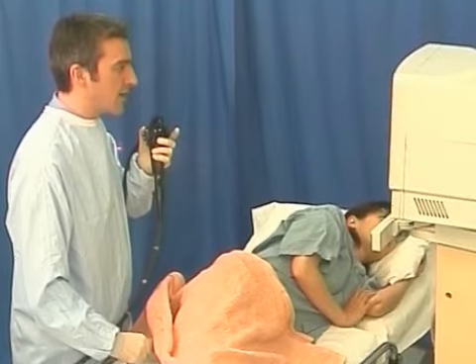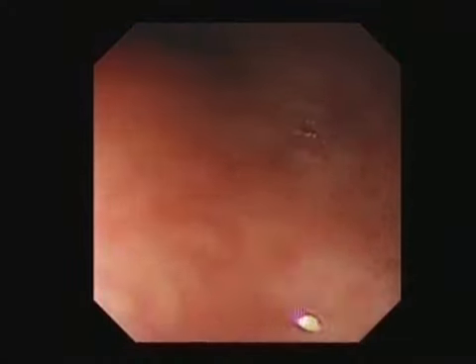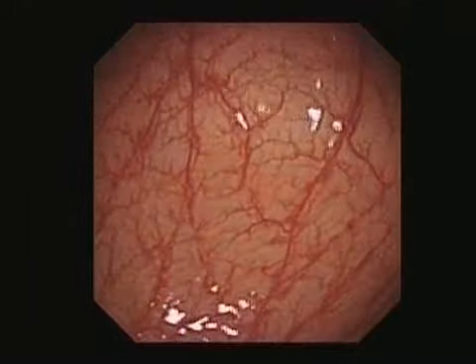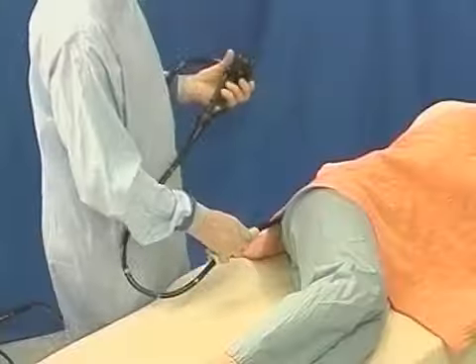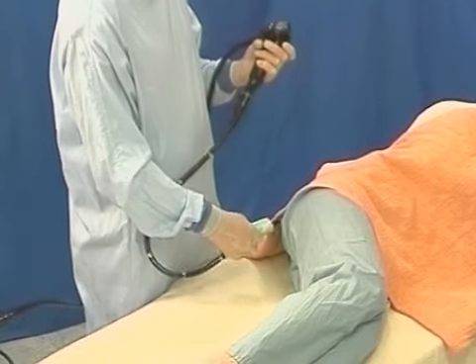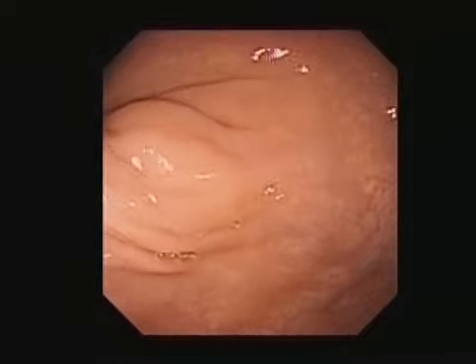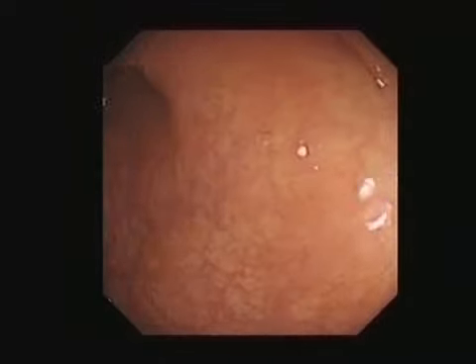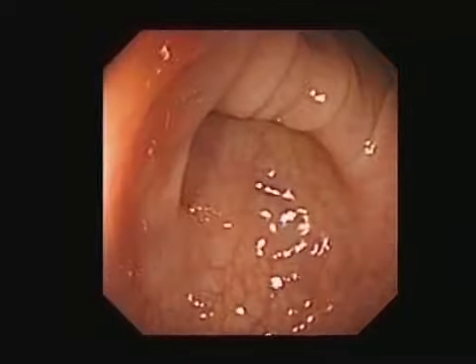It takes concentration to follow the lumen in close-up, avoiding mistakes and redouts, and watching the vessel pattern in case the colon rotates. Small, coordinated movements are needed to torque steer or corkscrew through the sigmoid. Steer smoothly, keeping a sense of direction. Slow and precise steering movements avoid losing the view.